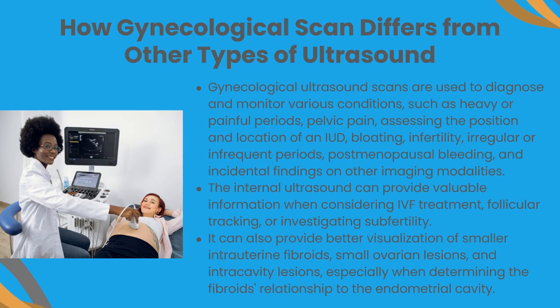Gynecological ultrasound scans are used to diagnose and monitor various conditions such as heavy or painful periods, pelvic pain, assessing the position and location of an IUD, bloating, infertility, irregular or infrequent periods, postmenopausal bleeding, and incidental findings on other imaging modalities.